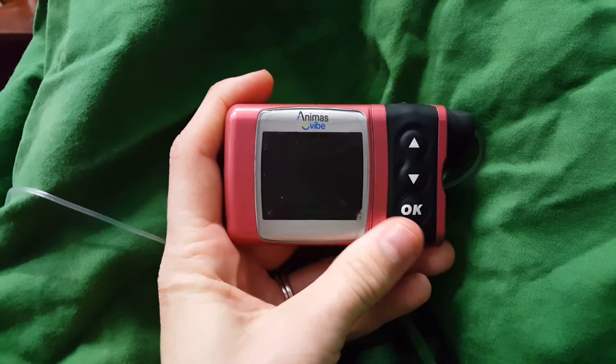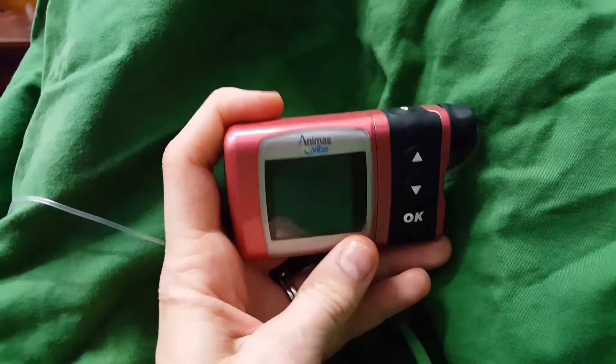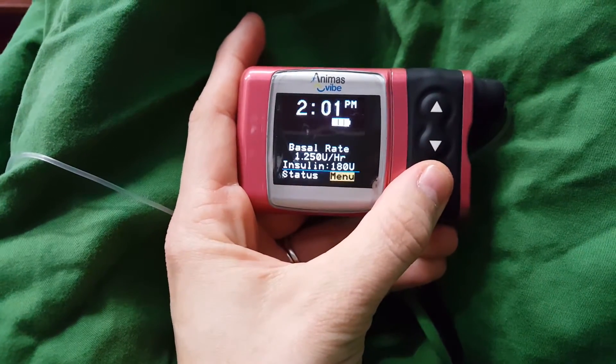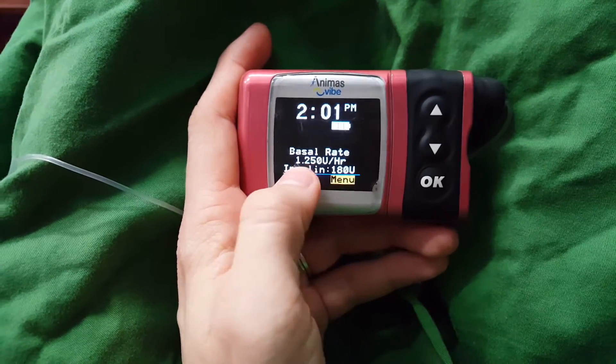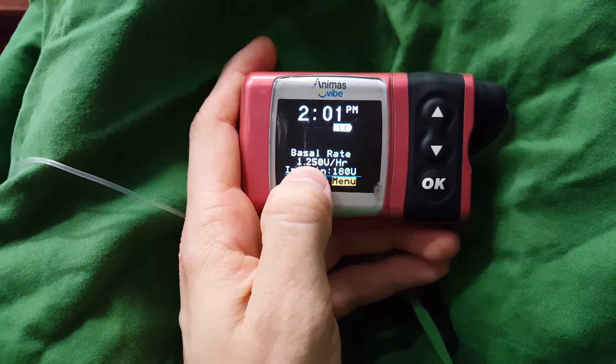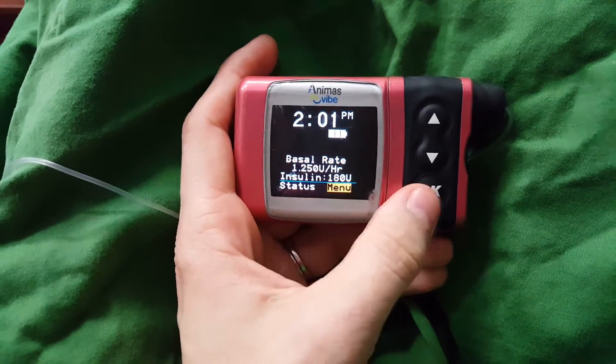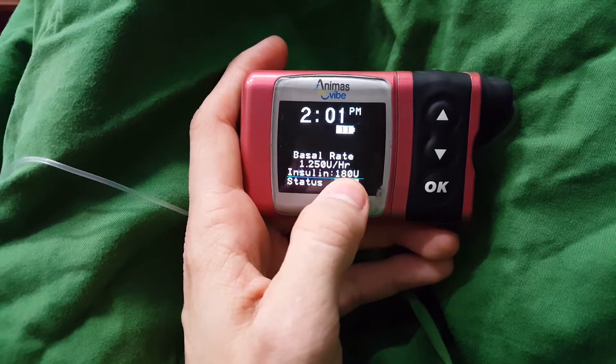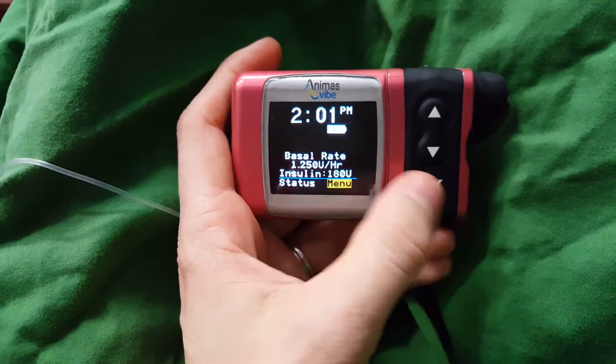So this is my Animas Vibe. I've had it probably about three years maybe. Turning on the screen, that's what it looks like. My basal rate at the moment is 1.25 units per hour. I'll show you how to change that and look at that in a minute. That also shows you how much insulin you've got left in the cartridge — I replaced that just this morning.